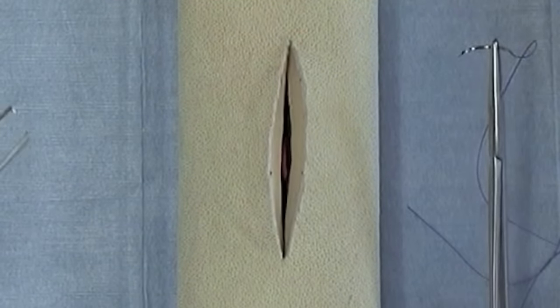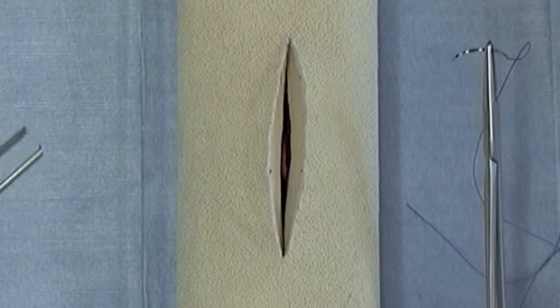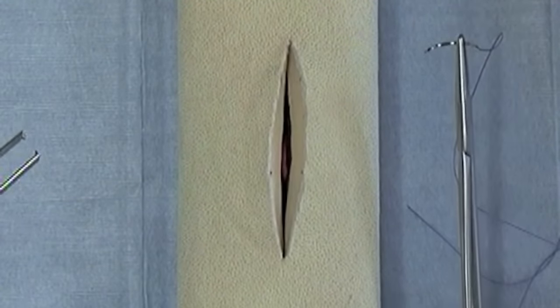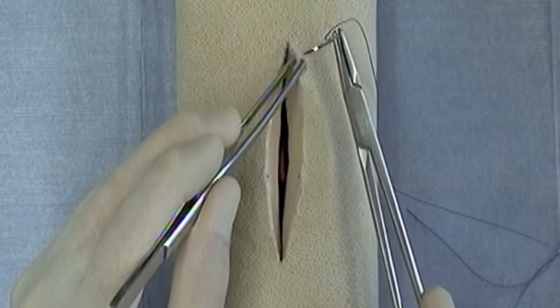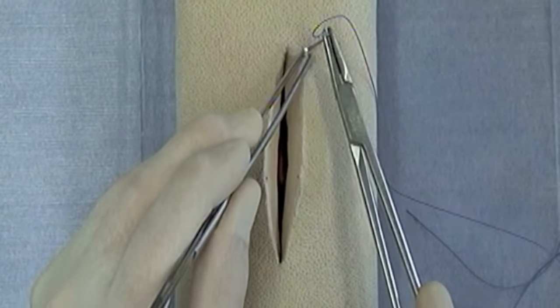The simple continuous suture pattern is one of the most common suture patterns you'll be using in practice, along with the simple interrupted pattern. To begin a simple continuous pattern, you simply perform a simple interrupted suture: full thickness bite, full thickness bite.